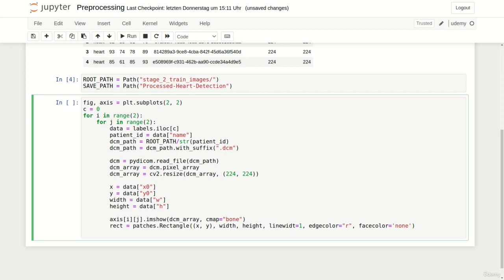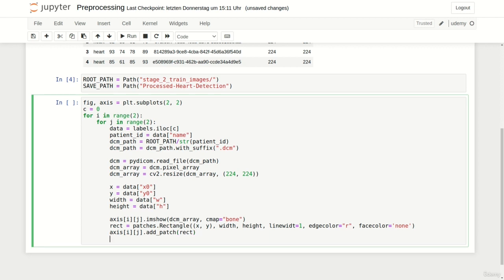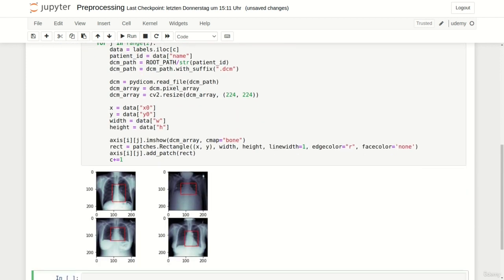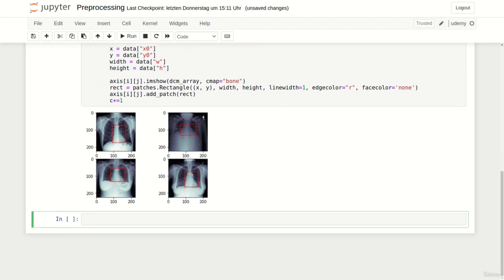We now simply access our current axis object again and call add_patch to which we pass our predefined rectangle. Now we simply need to update our loop counter variable and we're ready to inspect our images. Oh and of course we also should spell line width correctly. Perfect everything worked and now we can see four different x-ray images with their corresponding bounding boxes around the hearts.